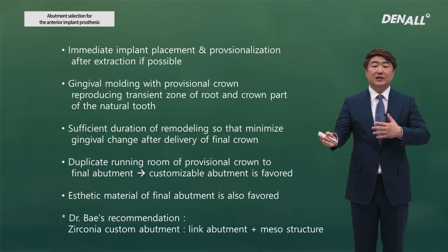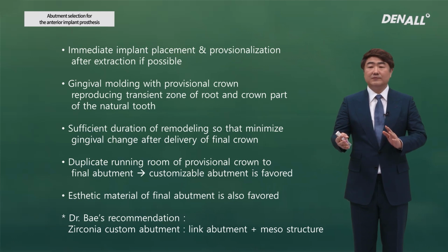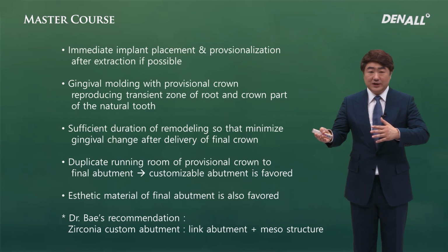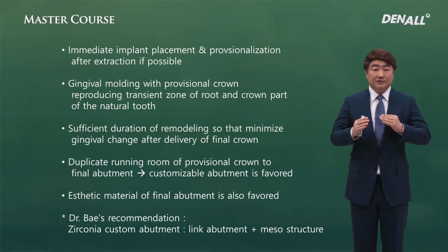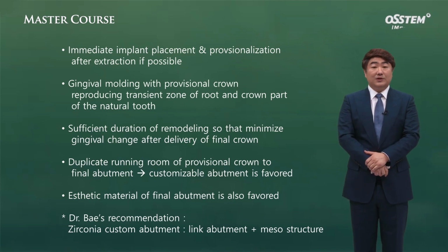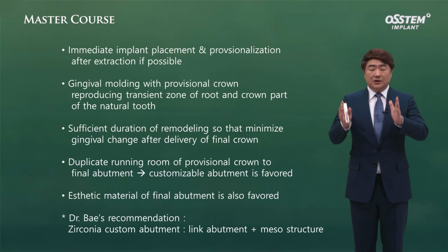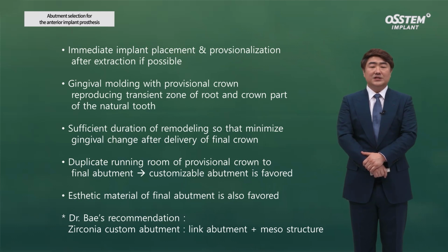In the impression for the final abutment, the temporary's running room needs to be imitated. Hence, a customized impression coping would be the most ideal choice, but if you use CAD/CAM, then whatever impression you take or whatever scan you do, the temporary's outer part can be reflected, so any limitation in impression taking becomes less important.